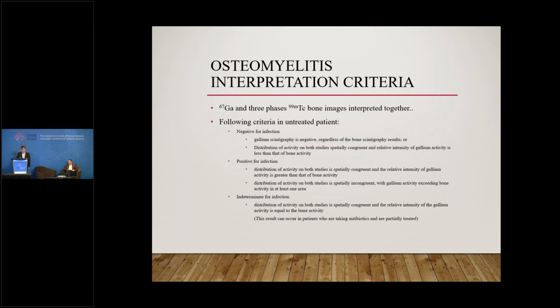Now, the criteria for positivity for osteomyelitis is the distribution of activity on both studies is spatially congruent, with the relative intensity of gallium being greater than that of the bone scan. Or if the activity of both studies is spatially incongruent, with the gallium being more extensive than on the bone scan in at least one region.